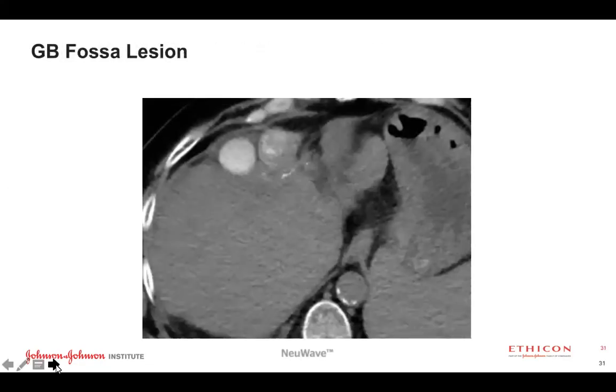And then the gallbladder I get asked about a lot as well. Lesions adjacent to the gallbladder, how to handle that. Different people have had different strategies for this. Some people do chemical ablation along the margin of the gallbladder, and then microwave ablation to the remainder. Some people do non-thermal techniques, but I think you can definitely do ablation of these with thermal energy.